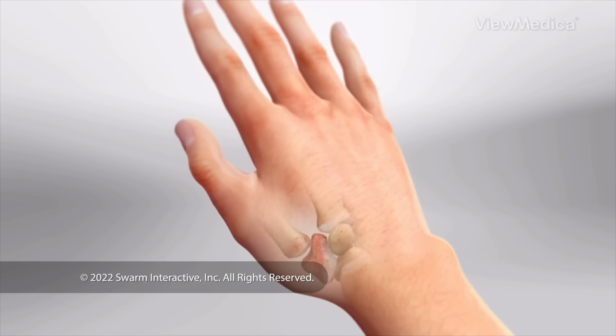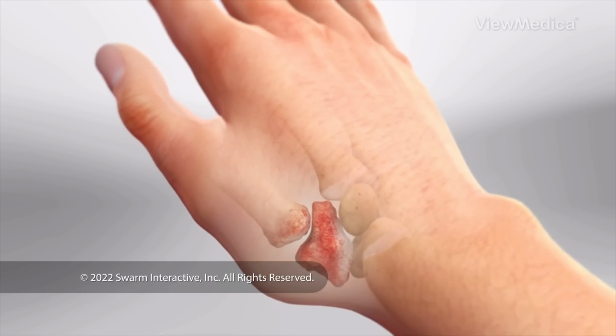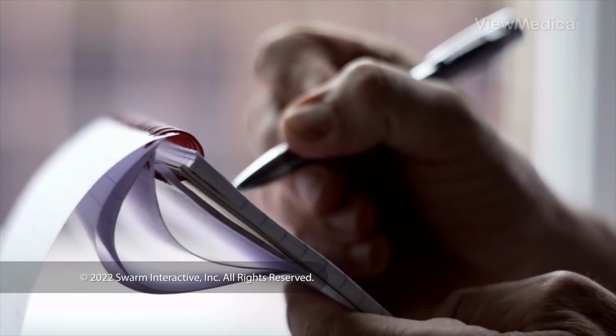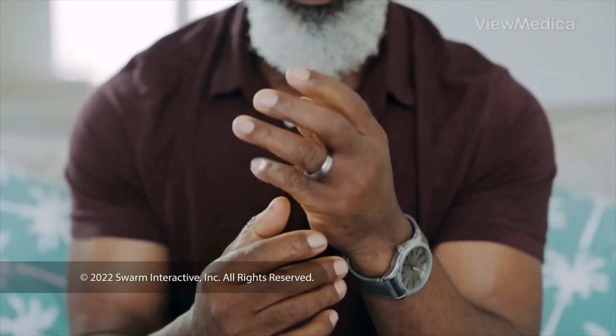This surgery treats arthritis of the basal joint. That's the joint at the base of your thumb. It lets you move your thumb to pinch and grip objects. Treating this joint relieves pain and restores range of motion.